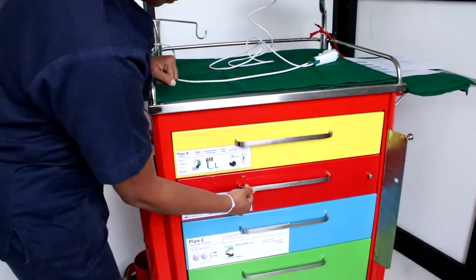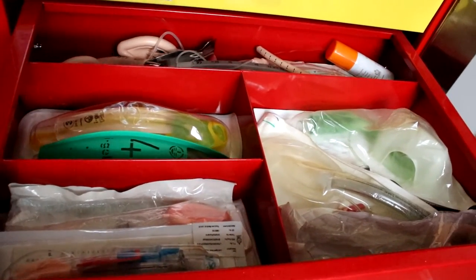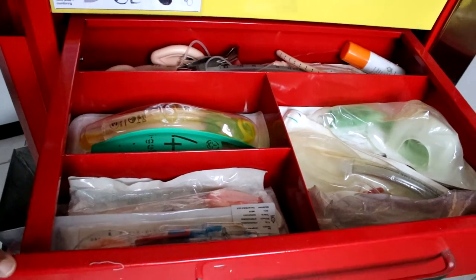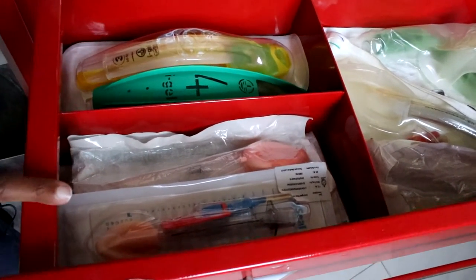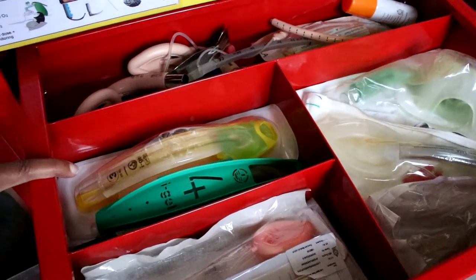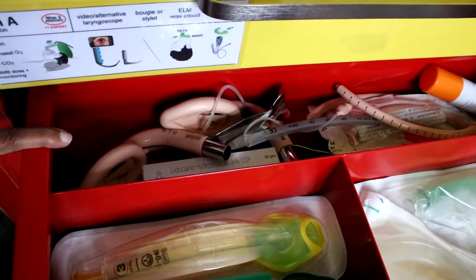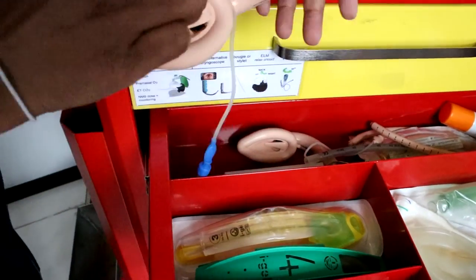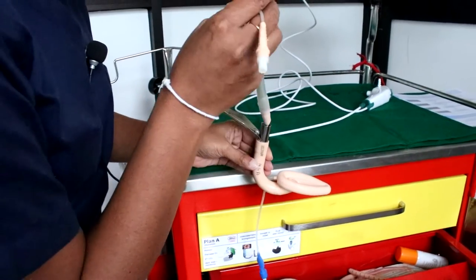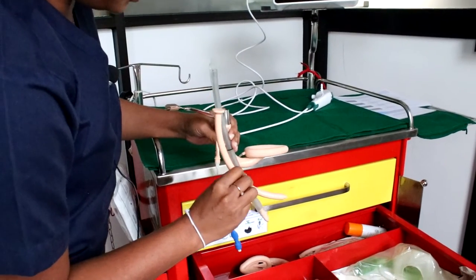Let's move to drawer B. According to the Difficult Airway Society guidelines, if you have found it difficult to intubate, your priority is now oxygenation and ventilation of the patient. For that you will need supraglottic airway devices of different sizes. The second-generation supraglottic airway devices are stored here — size 3 and size 4 i-gel. Very importantly, you also have the intubating LMA here, along with the ET tube that can be facilitated through it and the other equipment needed for intubation through the LMA.